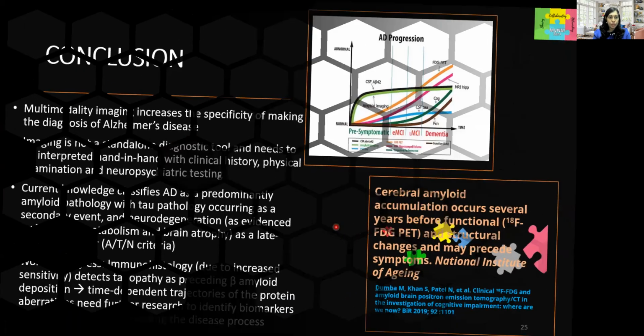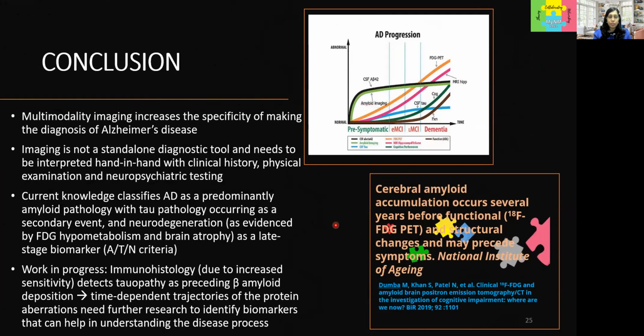Finally, I would like to conclude by saying that multimodality imaging increases the specificity of making the diagnosis of Alzheimer's disease and other dementias. Imaging, however, is not a standalone diagnostic tool and needs to be interpreted hand in hand with clinical history, physical examination, and neuropsychiatric testing.